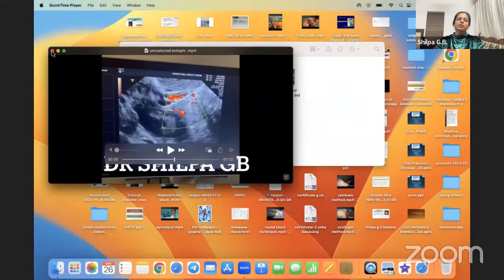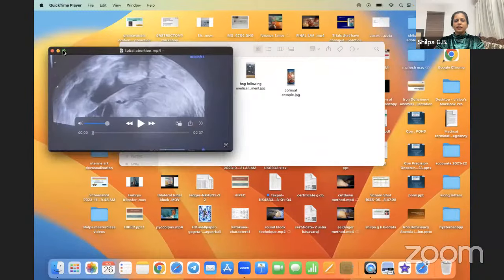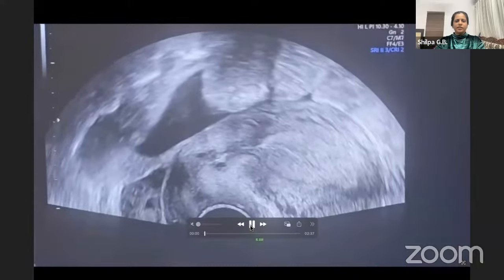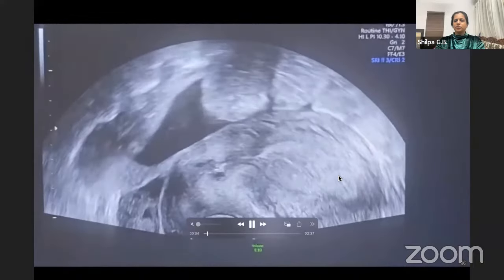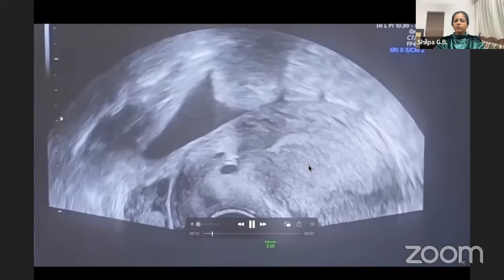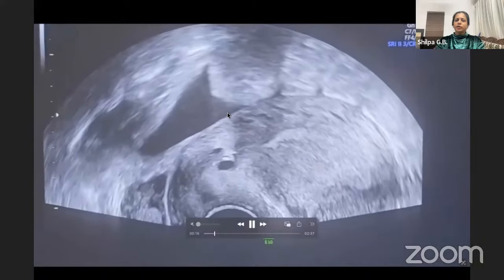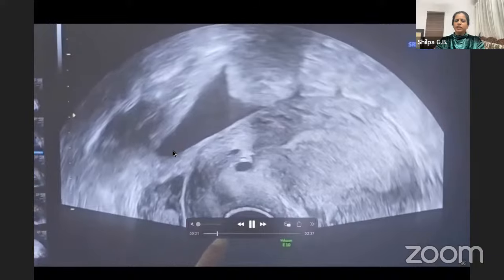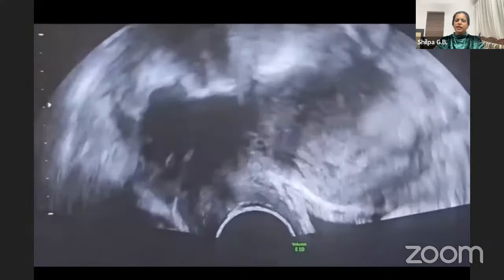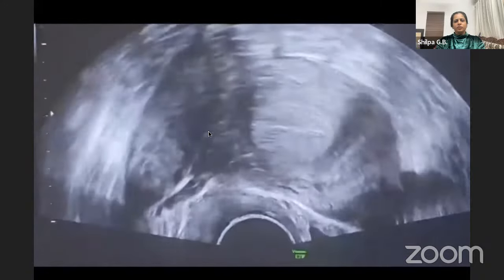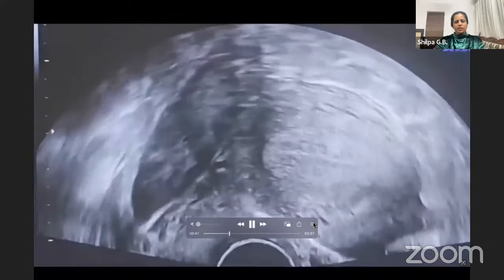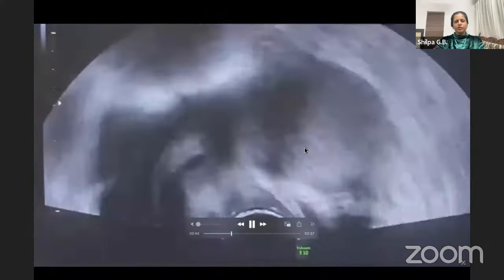This is another scan finding, courtesy Dr. Aarti Dindayal. Pregnancy test is positive and this is the sagittal section of the uterus - you don't see a pregnancy in there, but there is definitely fluid in the pouch of Douglas. You can see fluid in the POD and when you sweep the probe to look for the gestational sac you will not be able to see it in this case, but the fluid is quite evident. The transverse section of the uterus also confirms no sac in there.